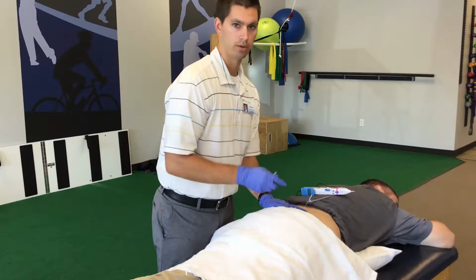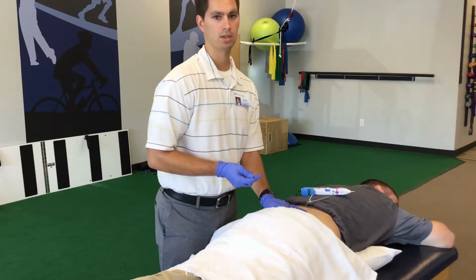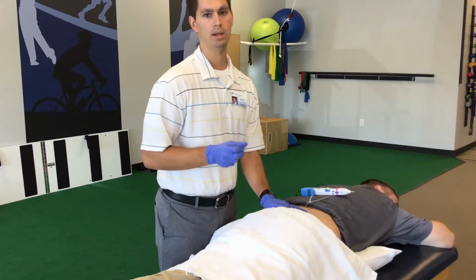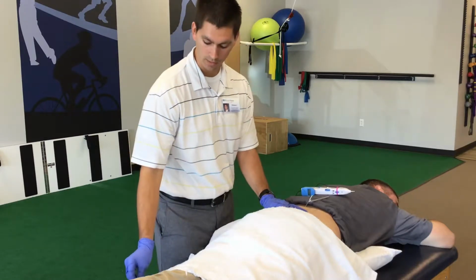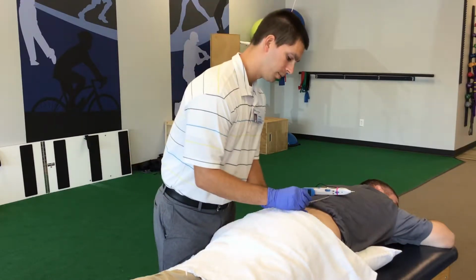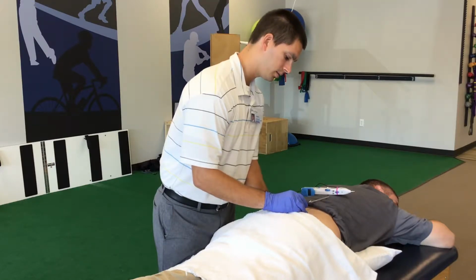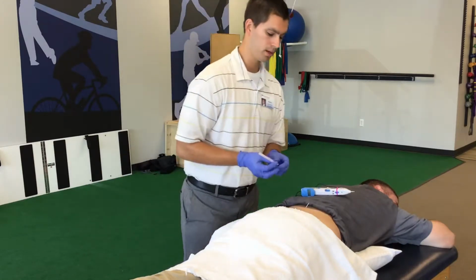So now the needle's poked through the skin, and now what he's going to experience is a dull, crampy, achy type of sensation. What's not normal is a sharp pain, any numbness, tingling, any weird zinging feeling down the leg. That's the stuff that we're trying to avoid. And so we just put the needle in until we hit the spinous process. You doing all right here, Josh? Yep. Dull, crampy, achy sensation.